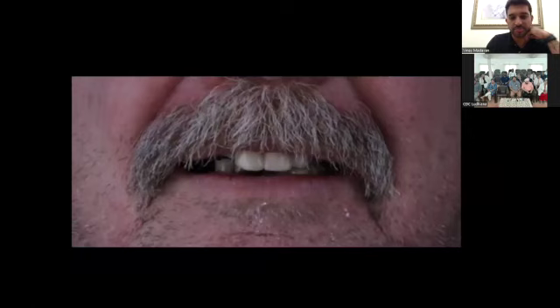That way you can see the tissue prosthetic junction if you were able to do a fixed prosthesis in these patients. Again, this is a close-up view. If I were to build these teeth back up, I do not want my incisal edge to be in this position. I would rather modify it and place it a little bit higher. That way it's more aesthetic, all right?